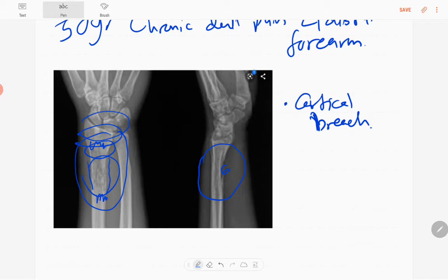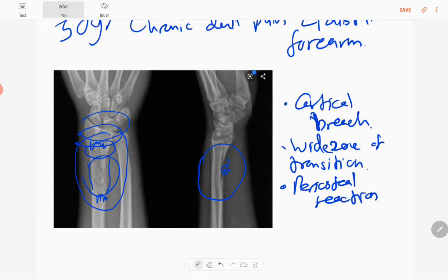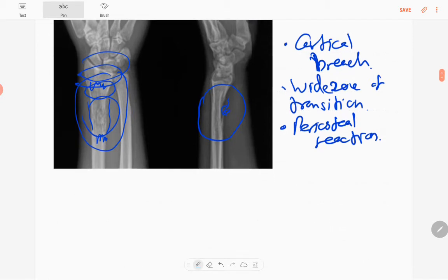The wide zone of transition is an aggressive feature. There is periosteal reaction visible in these regions, and there is a possible soft tissue component in the medial part of the distal radius.